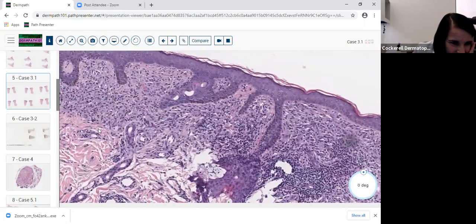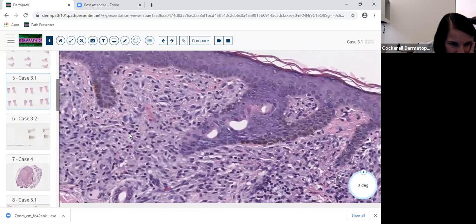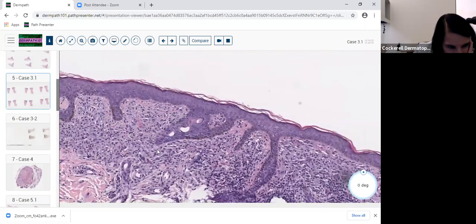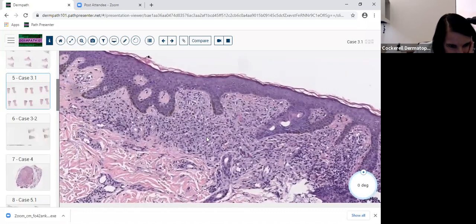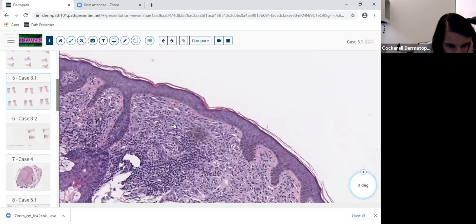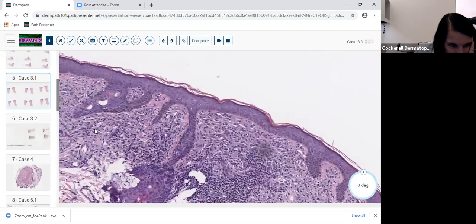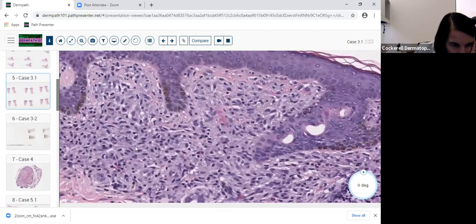And you're like, no, these really don't look like nevus cells. They're somewhat spindled. The cytoplasm is just all wrong for nevus. And I don't see a junctional component here. This just doesn't look like a nevus. It's not nested. It's somewhat band-like. So am I going to go off the rails and think this is lichen planus? No way, because these aren't lymphocytes. There's too much cytoplasm for these to be lymphocytes.